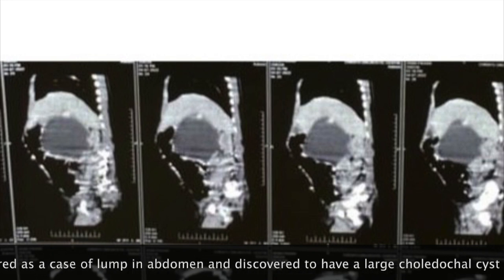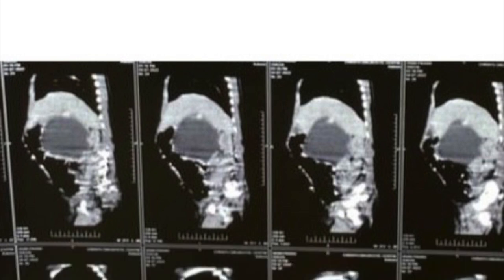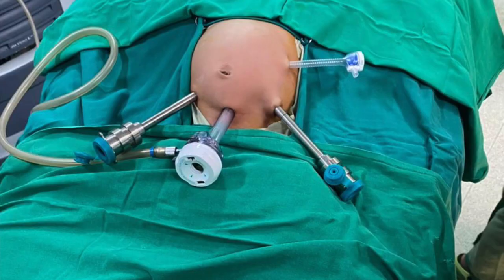Today we are going to discuss a case of a two-month-old child who was referred to us with a large lump in the abdomen. When we diagnosed and investigated, we found that he had a large choledochal cyst.